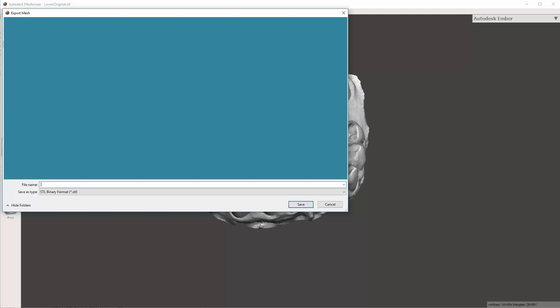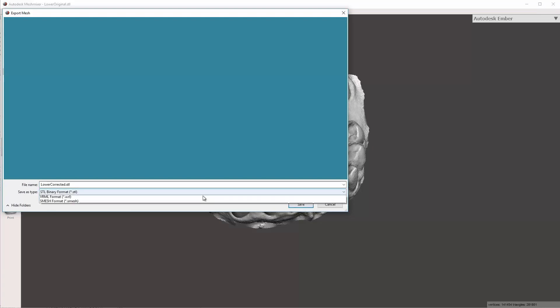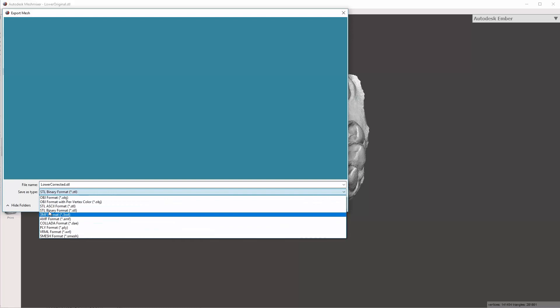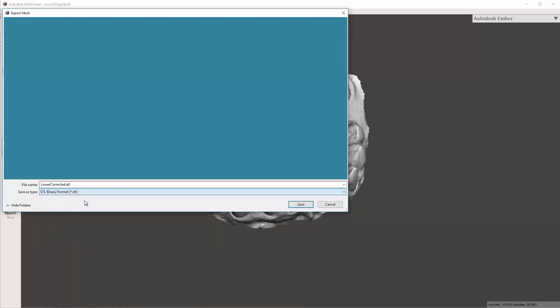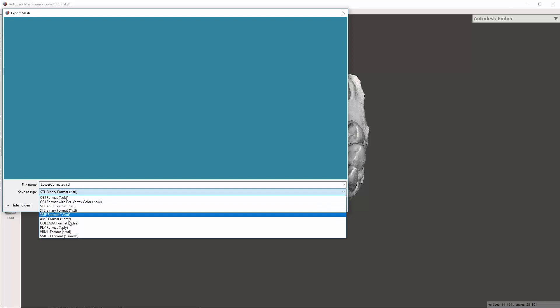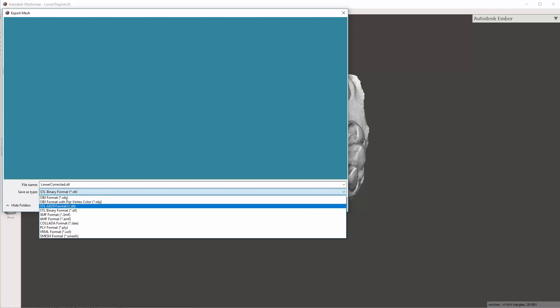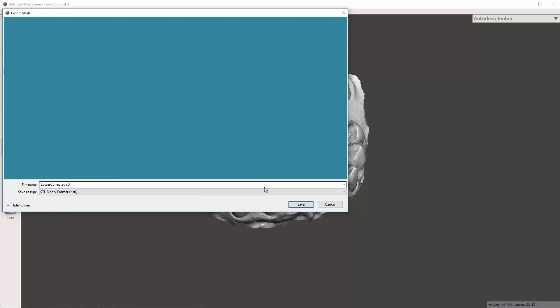I'm going to find the case that I am placing this into, and I'm going to call it my lower corrected model, making sure to save it as STL binary format. There are two types of STLs, and the ASCII format, but the ASCII tends to give a lot more volume space and has no real value to us.